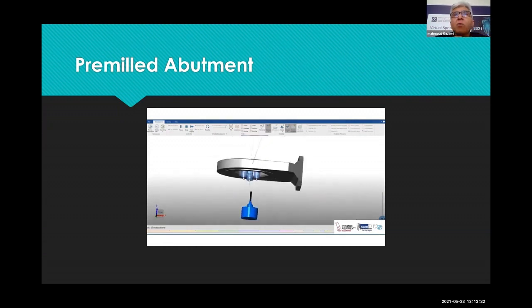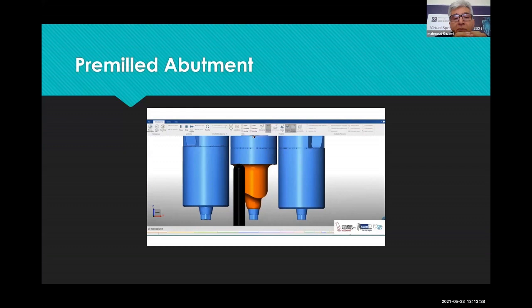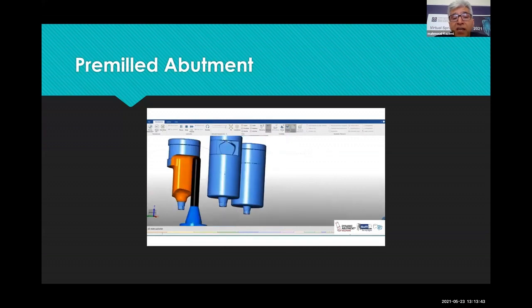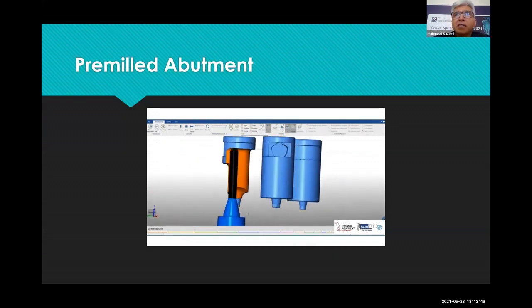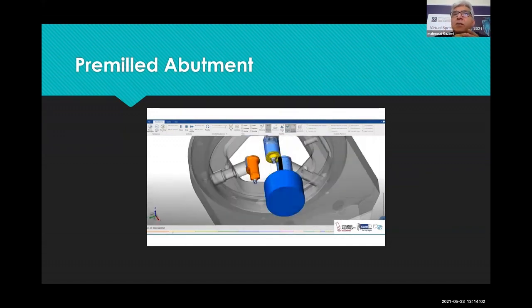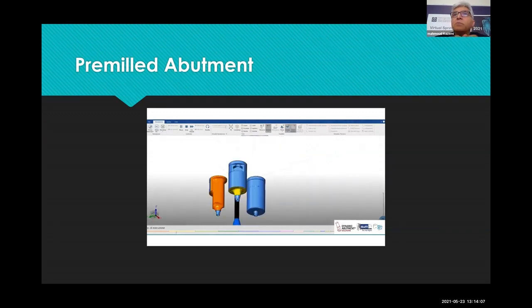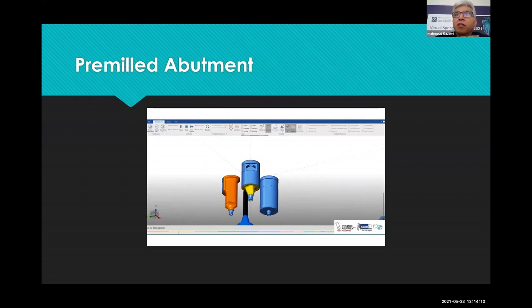One, someone thought that if we use a thicker customized abutment, in cases where we should use a cantilever pontic, we can decrease the length of the offset force, the cantilever area of the restoration, but it's not correct.